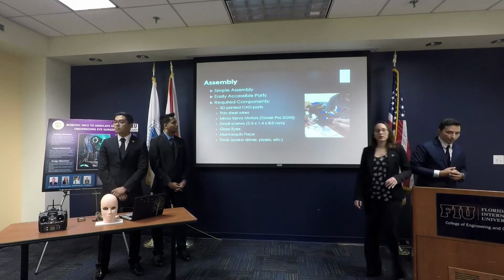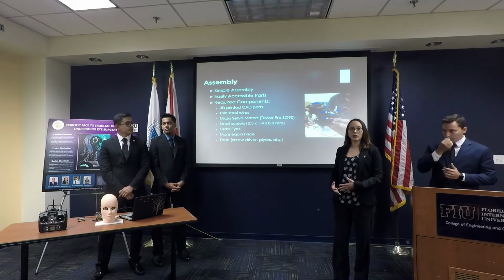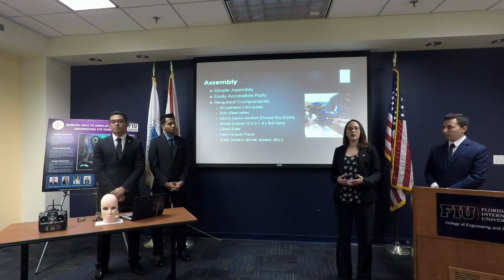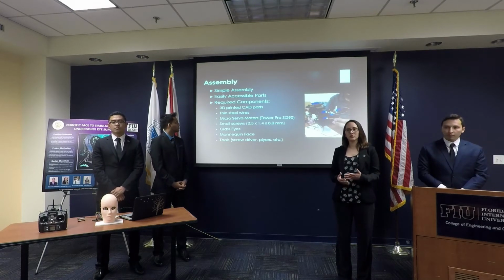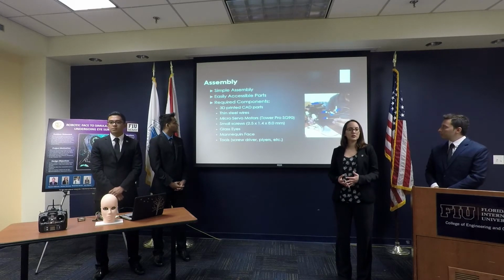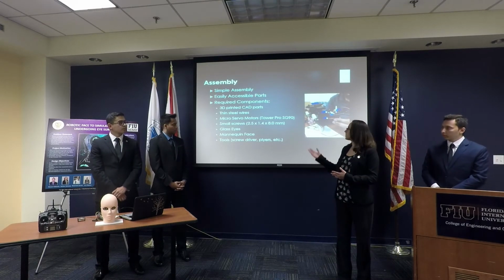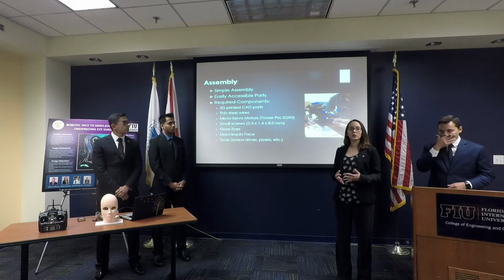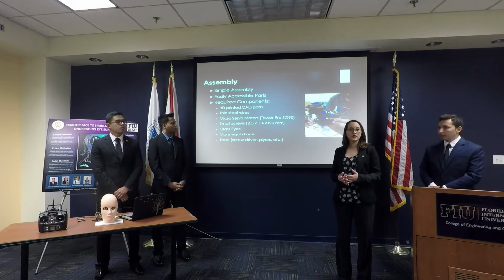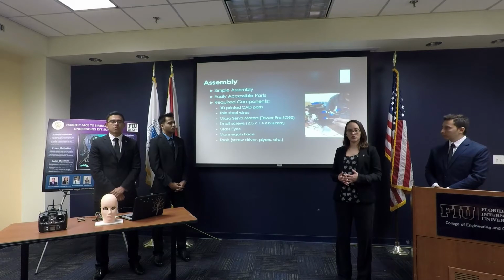As I mentioned, one of our objectives was to make it easily manufacturable and accessible, meaning that the assembly also has to be simple. For our easily accessible parts, we included our CAD model. Our CAD parts can be 3D printed anywhere, including your home, and it can be customized or made into different proportions if you like. The items that we use, such as the steel thin wires, the servo motors, the tiny screws, the glass eyes to make it look more realistic, and the mannequin face are also incredibly easy to access and cost effective.